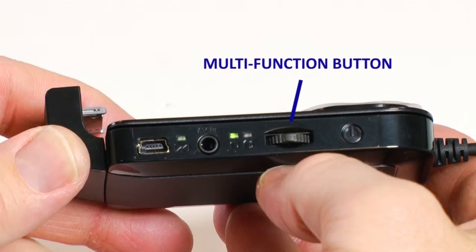The multi-function button also controls the 2D and 3D settings on the Cinemizer. Your Cinemizer has been set to default into 2D viewing mode, indicated by the green light. Holding down the multi-function button for several seconds will switch it from 2D to 3D, and the indicator light will turn blue.